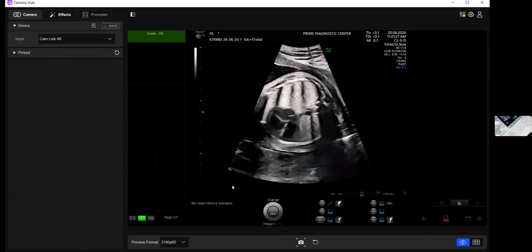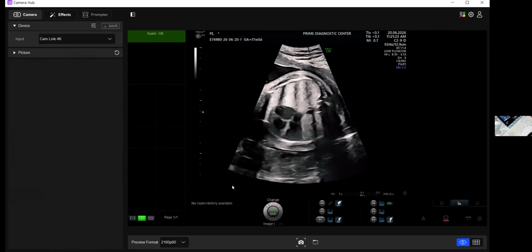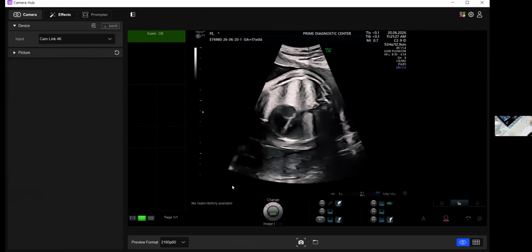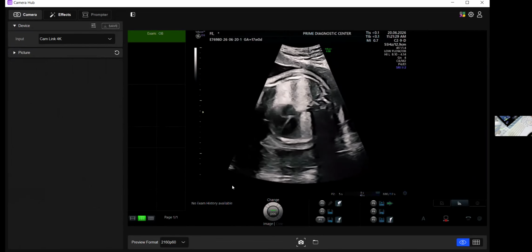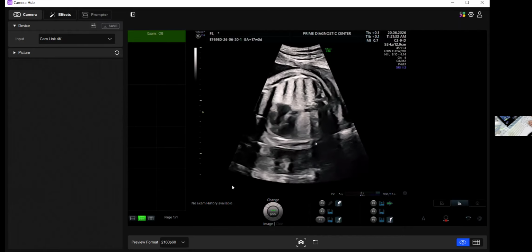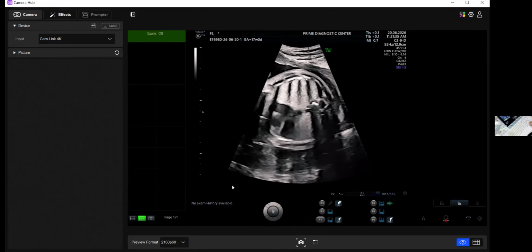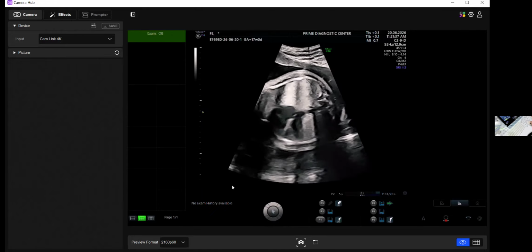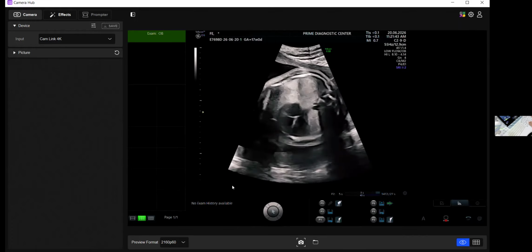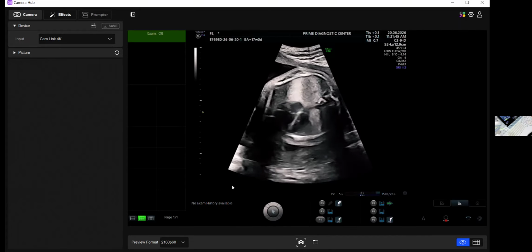So we are in a slightly different setting, which is a low flow setting, which we've created a preset, and then again try to get the spine, not like this when you see multiple ribs, and try to get a cross section. Now you see a single rib, that means that you are at the true cross section, and whatever measurement you take is going to be okay.